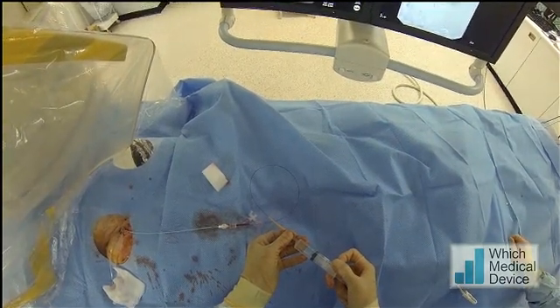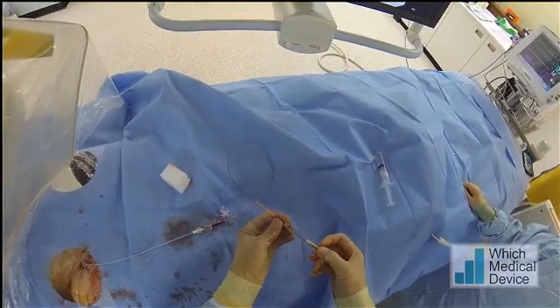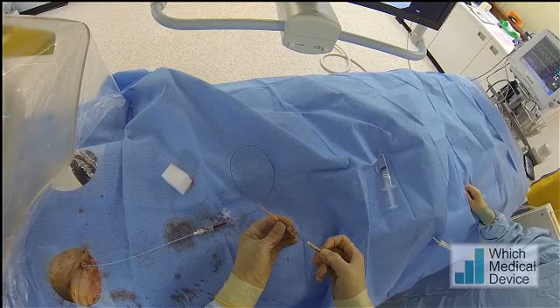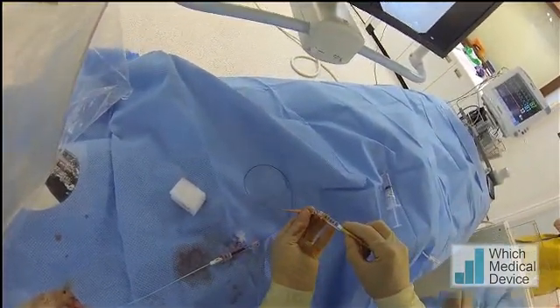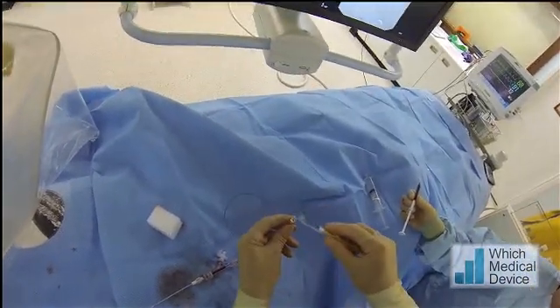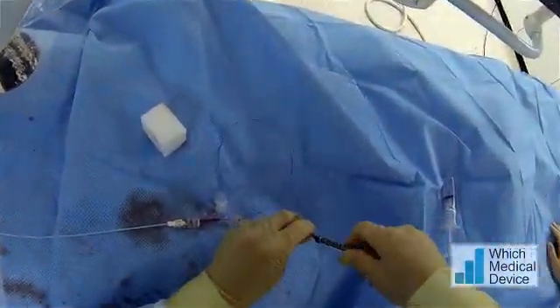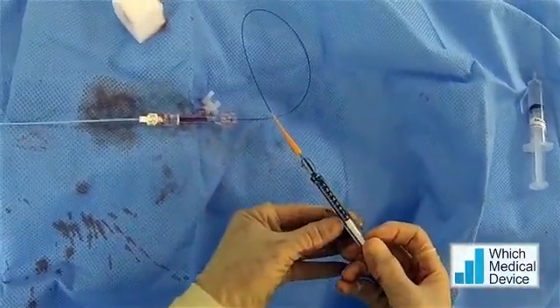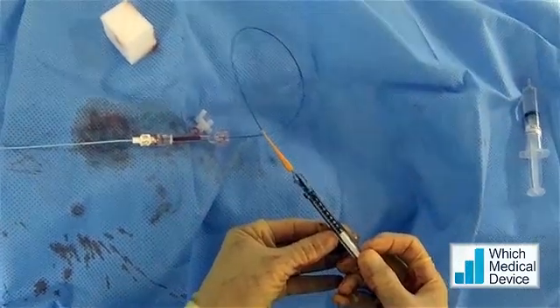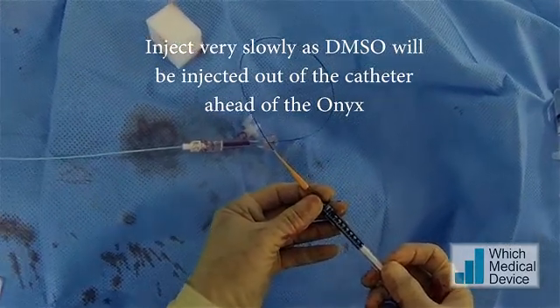Thoroughly flushing with saline. Now injecting the DMSO - approximately 0.4 of a ml. Filling the hub so we've got a meniscus of DMSO. Now we're just going to very slowly start injecting, because we've got about 0.4 mls of dead space. As we inject the Onyx into the catheter, that DMSO will be being injected out of the other end - it's important you don't do this too quickly.